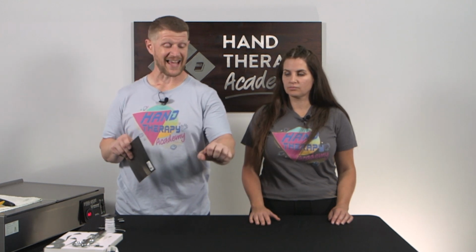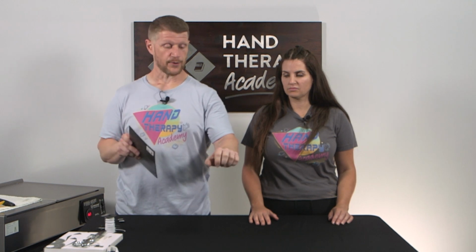And it holds the wrist in a given position because you can do wrist stuff without, but it gives them function because they can activate flexion but don't have extension of the digits. And so this splint brings them back up and they can activate through, gives them function in a low profile way without this big coat hanger hanging off their hand.